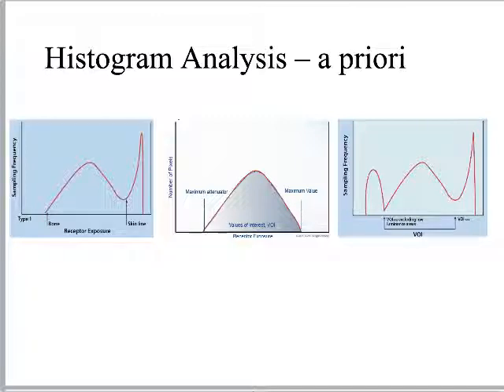But if you can imagine looking at these two pictures, I like these pictures a lot because it actually shows you the white here for the S min, and it shows you the black there for the S max, right? But if we look at that picture above it, we've got a white that goes a little bit further out, and we've got a black that goes much past where the S max is defined. So when we determine this is the exposure field, we're getting rid of everything outside of it.